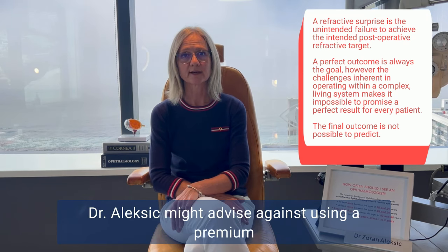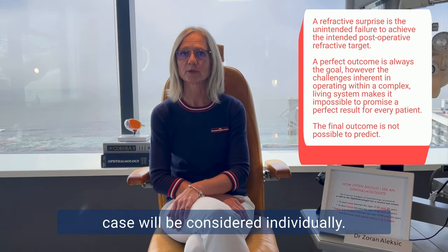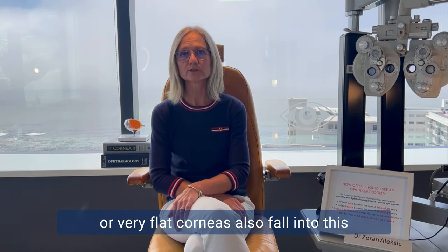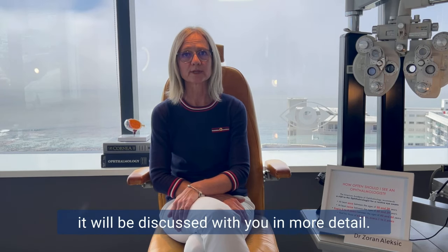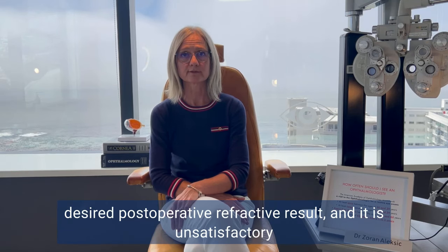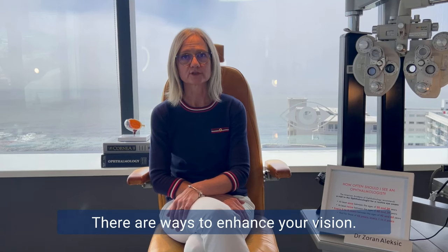Aleksic might advise against using a premium intraocular lens in these cases, but each case will be considered individually. People with high refractive errors or very steep or very flat corneas also fall into this category and may have a refractive surprise. If we find that you fall into this category, it will be discussed with you in more detail. In cases where we do not achieve the desired post-operative refractive result, and it is unsatisfactory for both the patient and the surgeon, there are ways to enhance your vision.